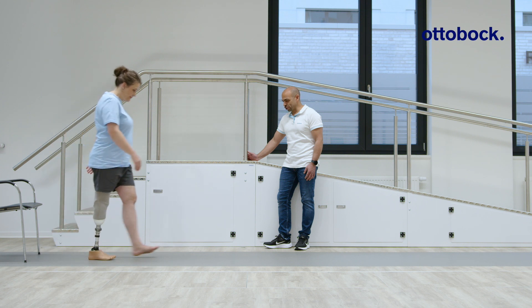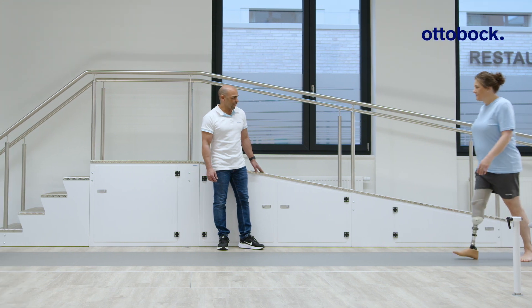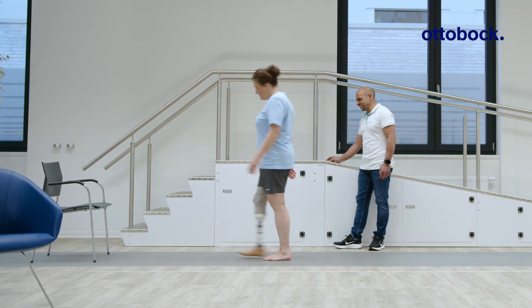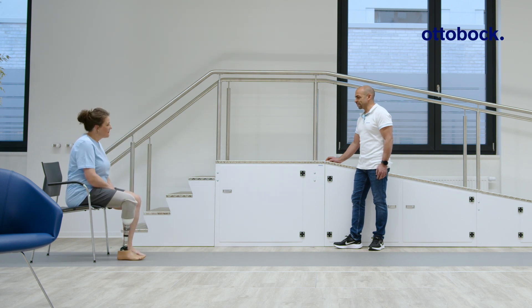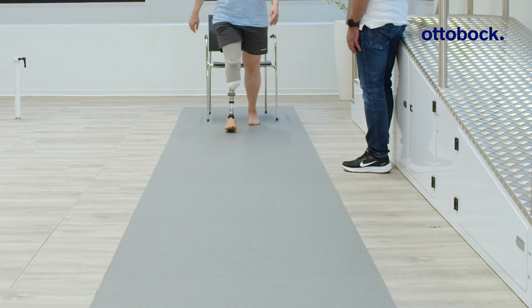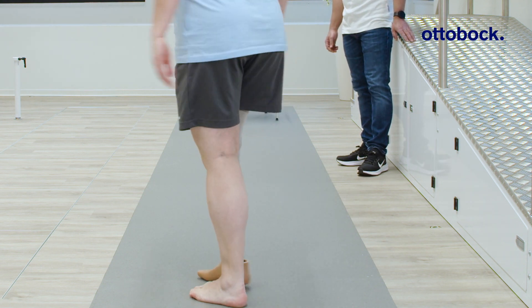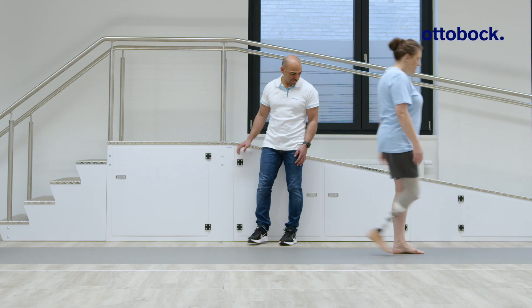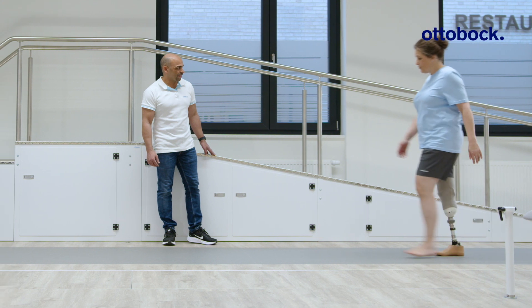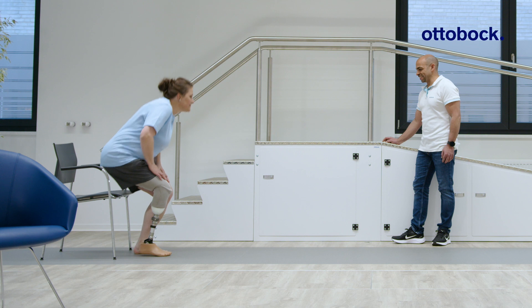Assess the user's gait in the frontal and sagittal plane when walking barefoot, following the Ottobock dynamic alignment recommendations. Pay attention to deviations in gait and ask the user how comfortable the prosthesis feels. Adjust the alignment until an optimal level of balance, stability and comfort is achieved. In particular, observe the behavior of the prosthetic foot at heel strike and during loading response. Replace the heel wedge with a harder or softer heel wedge if necessary.